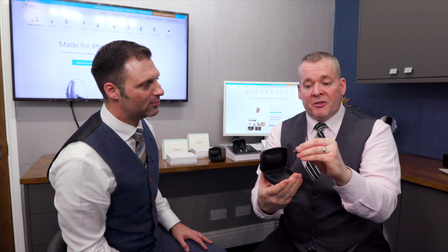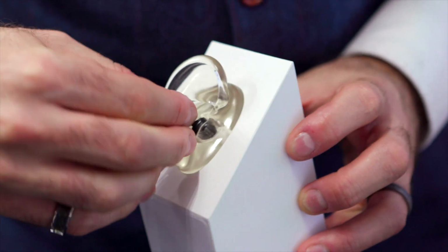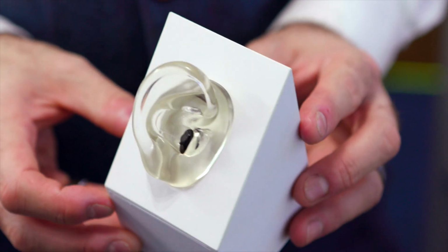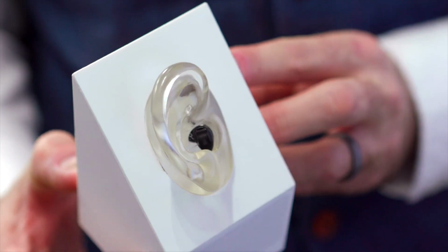Invisible in canal, IIC, is the style. So labelled up left and right, so L and R, and when they're in the canal, you really don't see them. All you would see in what we call this intertragic notch is just possibly the little bobble which allows you to take them out. So they won't get lost in your ear. They won't get lost in your ear because you can probably see that's been made specifically for a patient's ear. Since we used to have hearing aids handmade, maybe 15% of the time they were getting remade to get the fit just right.